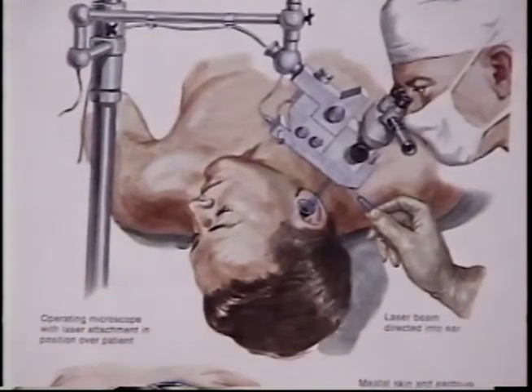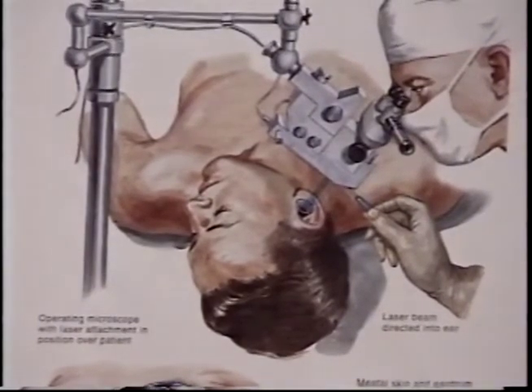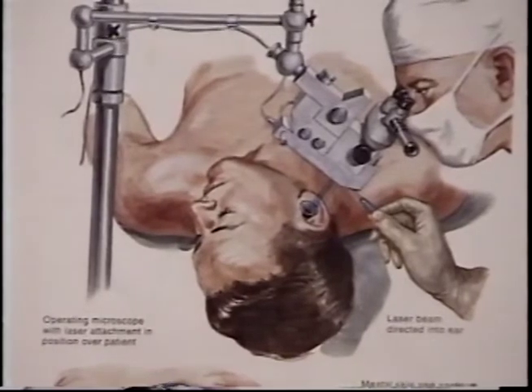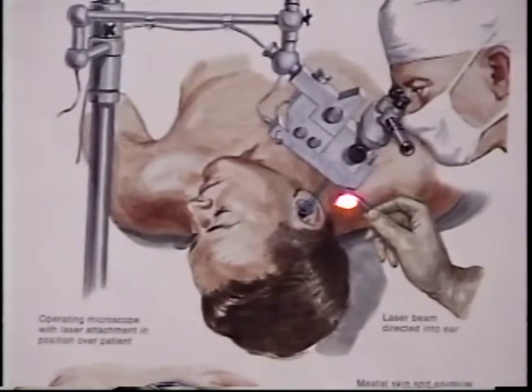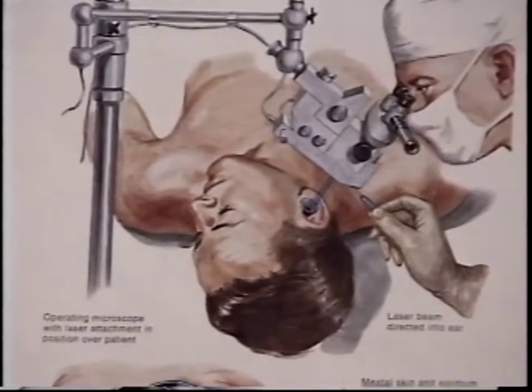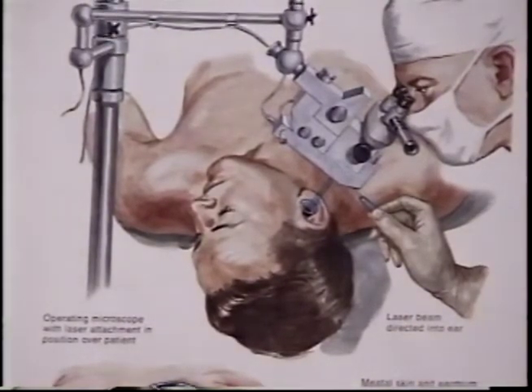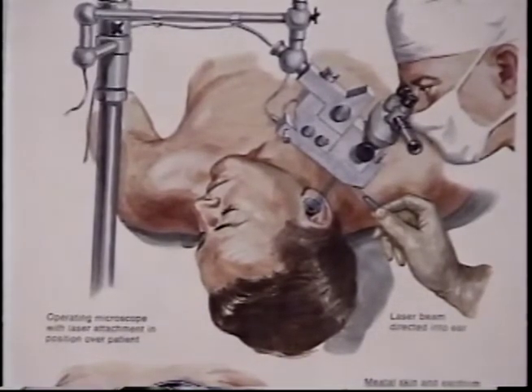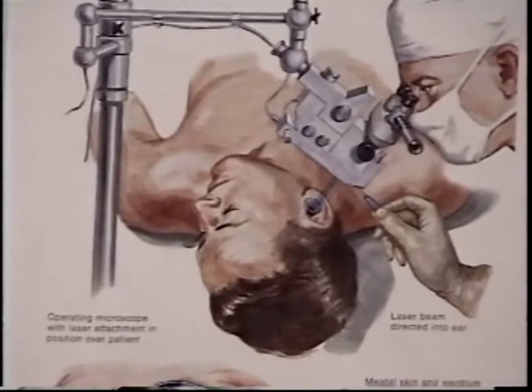Okay, we're going to discuss stapedectomy with a prosthesis first. The patients are taken into the operating room and actually placed under general anesthetic. The procedure takes about 1 hour. Here you can see the microscope. This blue line here represents a laser going through the microscope. Actually, we use the laser by holding it in our hand much like a pen now and doing the surgery with the laser in a handheld instrument.